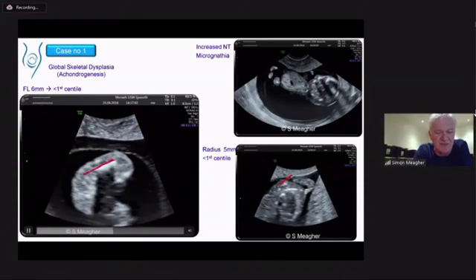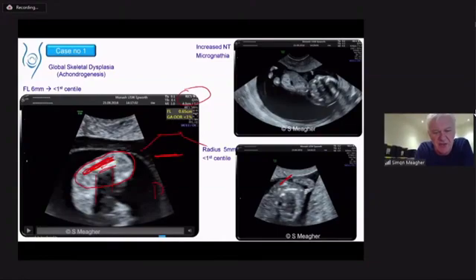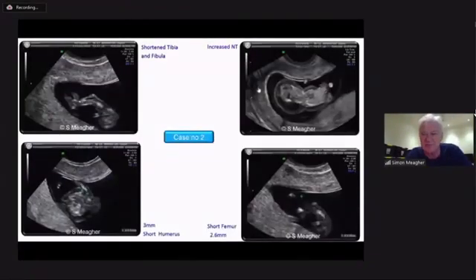Remember, this is an endovaginal scan. That's the length of what a femur should be inside a limb of this size. So this is the size of the shadowing. An important practical point that was asked earlier on, in terms of measuring long bones, you ideally want your long bone to be perpendicular to your beam, and you want to increase your dynamic range so you get the shadowing, so you get a precise measurement. This is probably the best position for getting accuracy in measuring limbs at any stage during pregnancy.